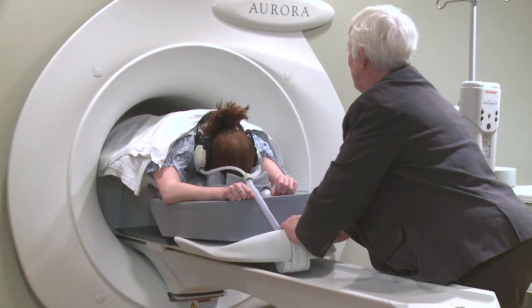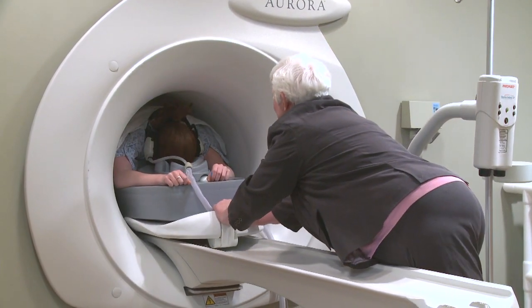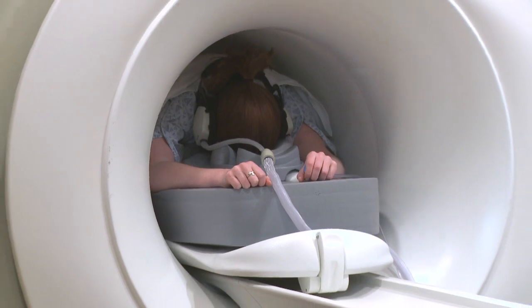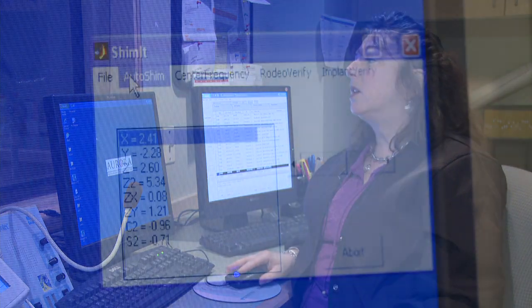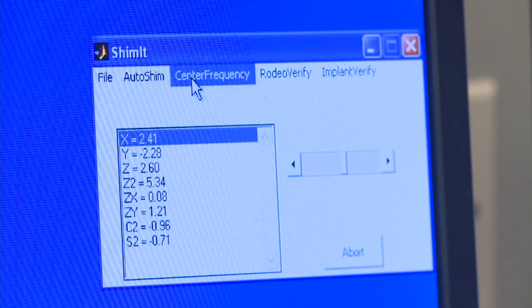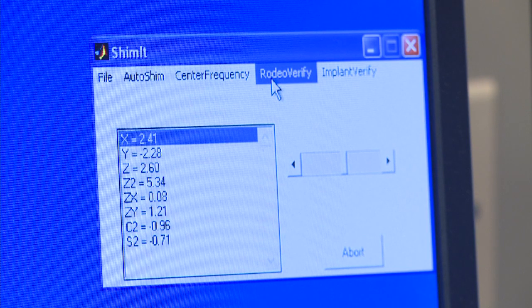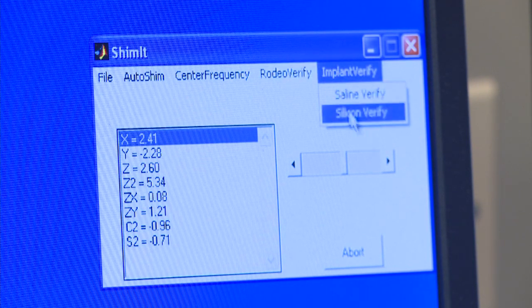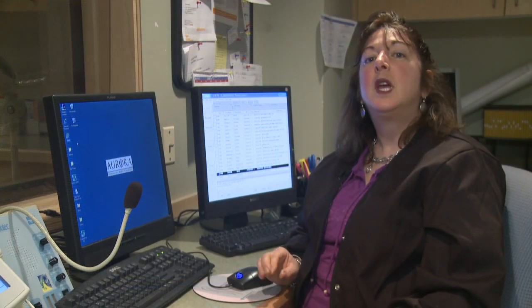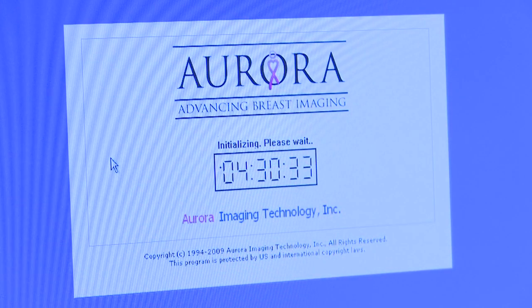So now we will slide her into position. This is a nice unit only because the patient goes in feet first and they're able to have their head at the opening at the edge of the magnet. So we have the patient in position and we're going to start the shimming process. We go through our auto shim process, then we move on to our center frequency, then we move on to our rodeo verify. If the patient does have implants, either saline or silicone, we'll scan accordingly. What this does is tune the patient. We look at the breast tissue to see what it's made of, and the system tunes in specifically to that patient.